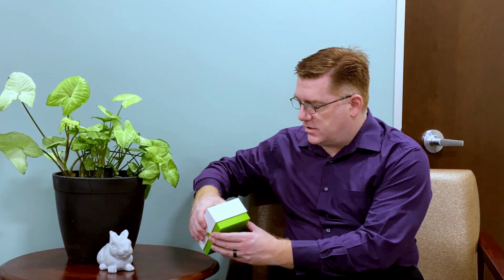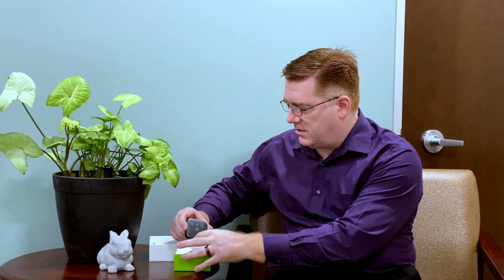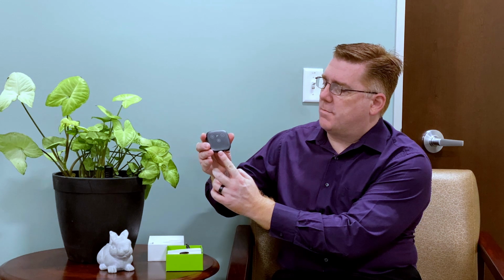But now another feature that these have available to them is what's called a TV connector. Let me get one out to show you. It's a very small device that can be hooked up to the TV. There's a cord that plugs in right here and then a power cord, but it's small enough you can basically Velcro this to the back of the TV. In fact, the manufacturer includes some Velcro. What this does is it transmits sound from the TV directly into the hearing aids without you having to wear any special accessories. You've used devices like this before. The previous set of Phonak hearing aids had what's called a TV link, and that was a bit bigger. It's about the same size as this box, maybe a little bit smaller, but this is definitely much smaller.